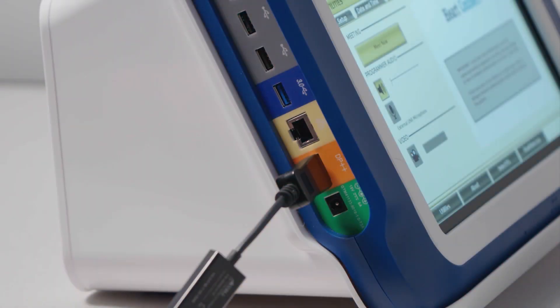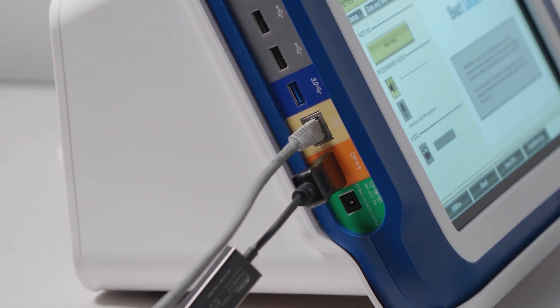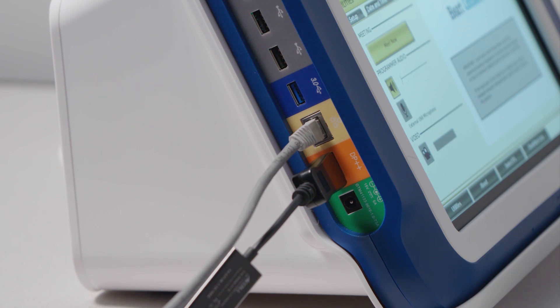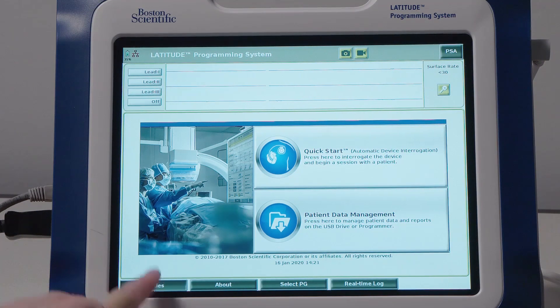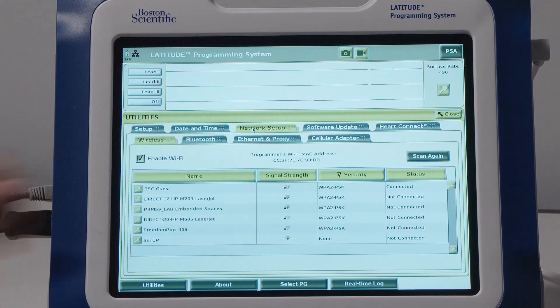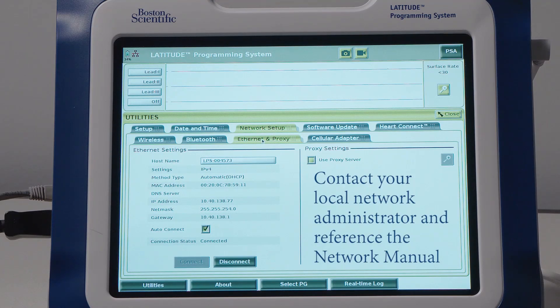The Ethernet port on the Model 3300 Programmer accommodates an RJ45 Ethernet port connector. It is designed for local area networking, or LAN, use only. Ethernet connectivity is the most reliable connectivity option based on the bandwidth needed for the HeartConnect system. To access, navigate to Utilities and then to the Network Setup tab. There you will find the Ethernet and Proxy tab. Contact the clinic or hospital local network administrator and view the Network and Connectivity Operators manual on bostonscientific.com/IFU for complete details.